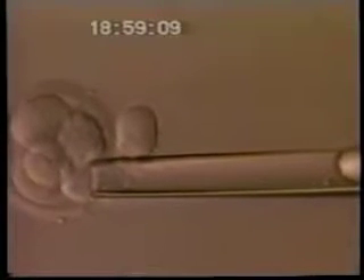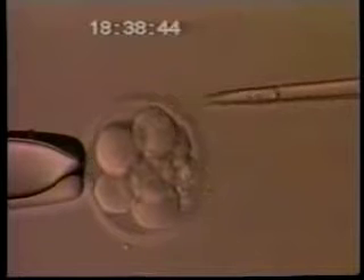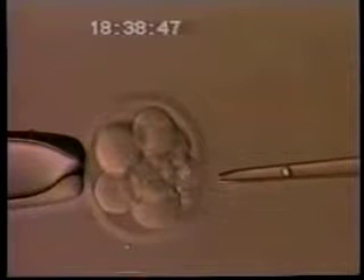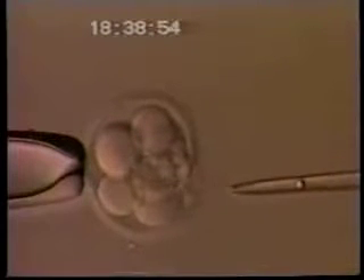You will see eventually, however, that some cells are very difficult to remove because what is called compaction has begun. In these first two embryos which we've just biopsied, compaction had not yet begun, so it was relatively easy to remove the two cells without damaging the rest of the embryo. In the third embryo you're about to see, compaction has begun and there are tighter connections between the blastomeres. You'll see that it is relatively difficult to get the cell out without damaging either the cell itself or the surrounding cells. Right now you're seeing that we're carefully making a hole in the outer shell by squirting acid tyrode solution on the zona pellucida.